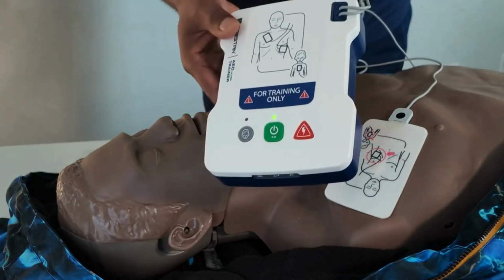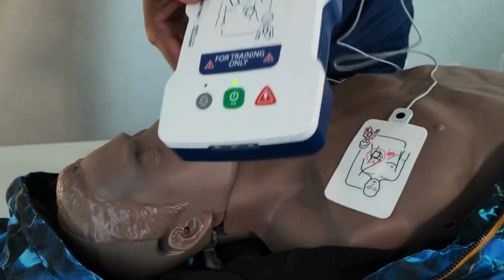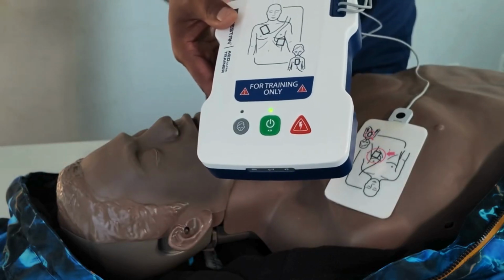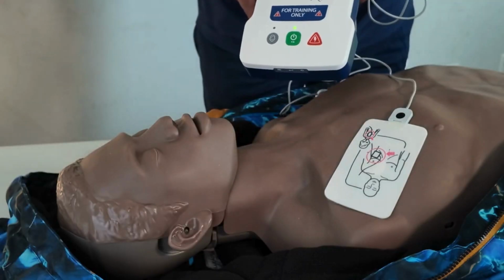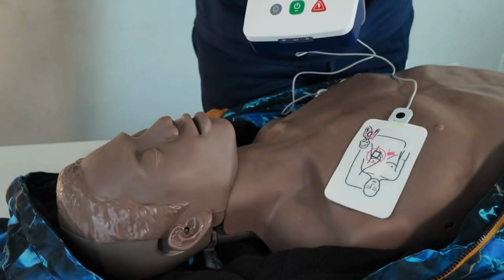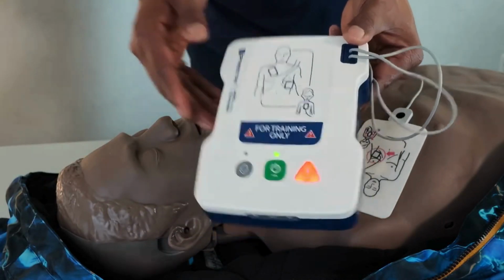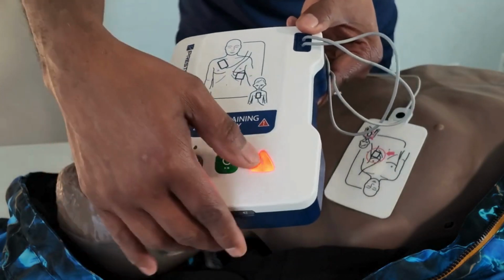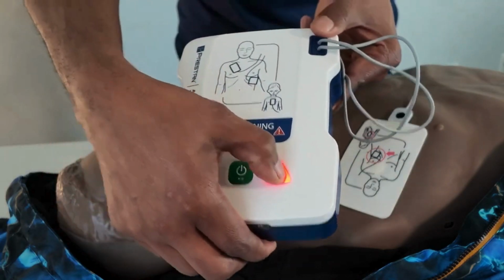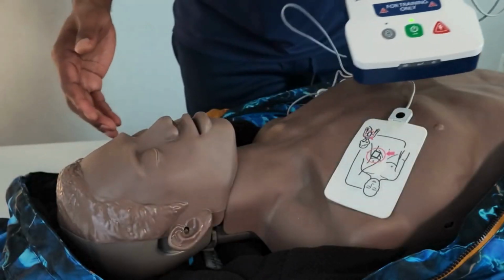Analyzing heart See, rhythm. this is the second time it's asking me to create Do not touch to the patient. give a shock. Analyzing heart rhythm. Shock advised. Do not touch the patient. Everyone clear. Press the flashing shock button. Press the shock button now. Shock delivered. Begin CPR.